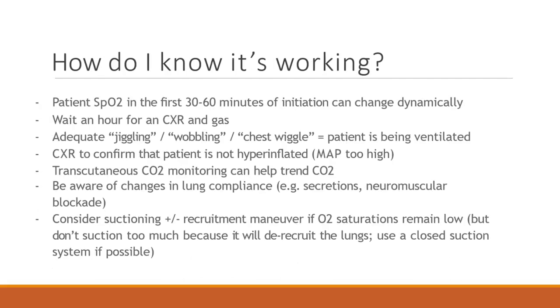So this is the part that makes everybody crazy, because this is such a great machine and it does a lot for the patient, but sometimes it takes a minute for it to work. So in that first 30 to 60 minutes, the SATs can change dramatically.